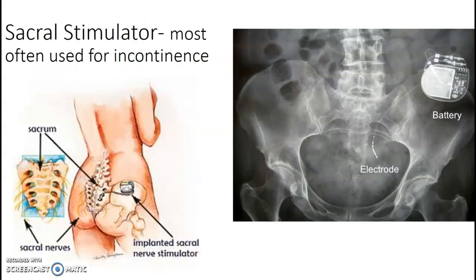Sacral stimulator. It's usually used for patients suffering from incontinence or some severe joint pain in the sacrum. The stimulator is placed similarly to the spinal stimulator — you're just going to center over the pelvis and show them where they are sacrum-wise.